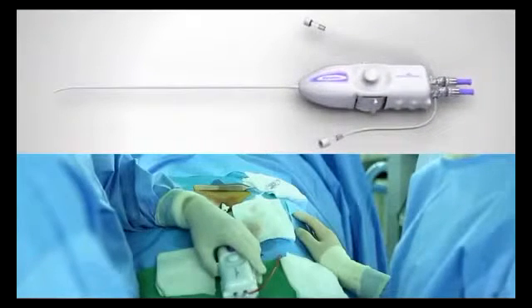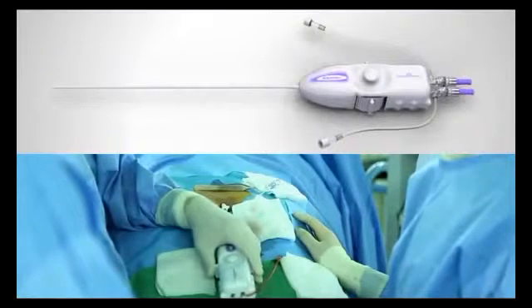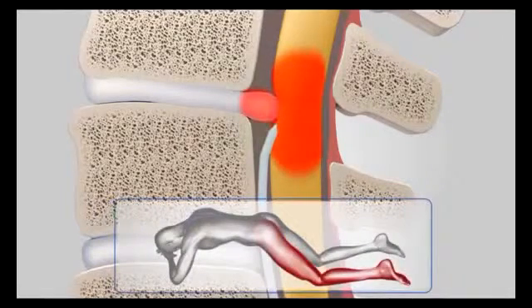After you reach the targeting point, you need to double confirm the disc area by steering the catheter to the left and right. If the patient complains of severe pain after slightly pushing the laser fiber to the supposed target point before stimulation, there is the possibility the laser fiber has touched a nerve. In other words, to use lasers safer, the surgeon should find out where the pain point is by stimulating with the laser fiber or endoscope cable.